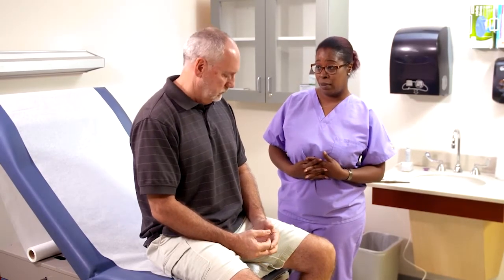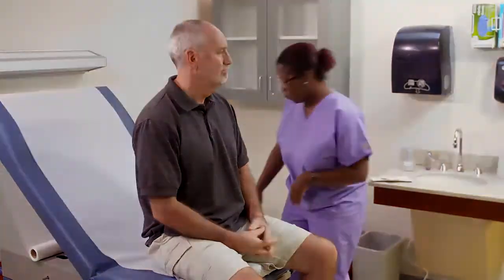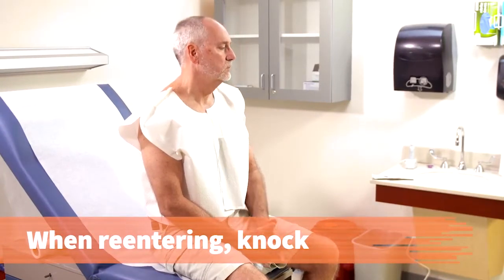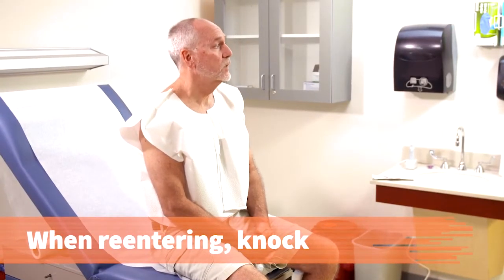I'm going to give you a gown. You're going to place it on open to the front, so you're going to undress from the waist up. Will you need any help with that? No, I should be fine. When re-entering the room, provide a courtesy knock on the door. Come in.